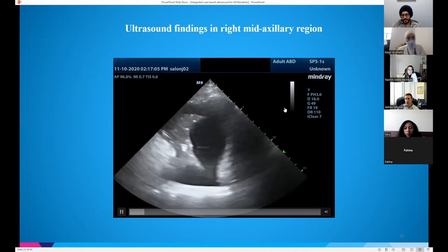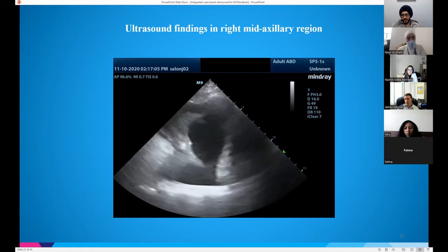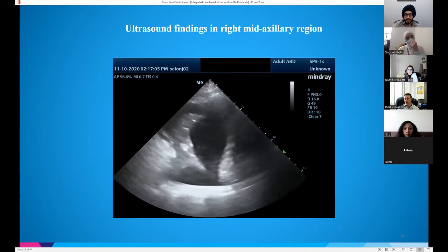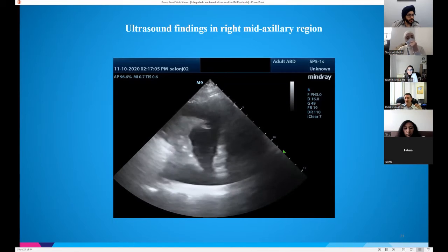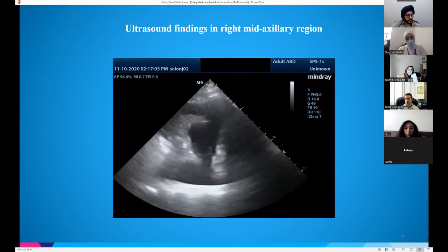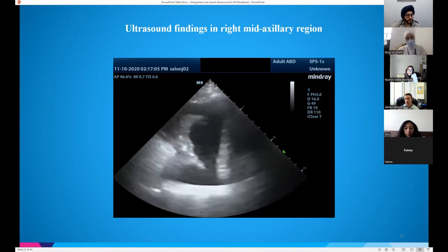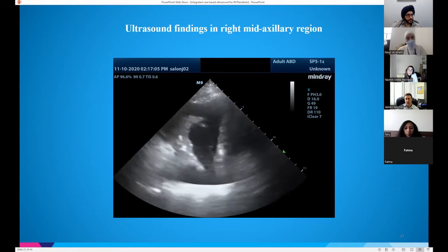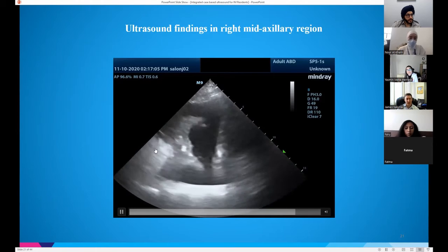This seems straightforward, but you don't want to bypass these small steps, because I'm telling you that we have had M&Ms on the pulmonary critical care side where chest tubes were put into the abdomen or put in inappropriate places because what they thought they were looking at was a pleural effusion, and it was just massive ascites, and the diaphragm was way up in the axilla. It happens more frequently than it should, because people bypass the simple things of just finding the anatomy, understanding what you look at. Never do an intervention, never stick a needle in something until you, as the proceduralist, are convinced you know what you're looking at. So I clearly see chest wall, I clearly see diaphragm, I clearly see lung.